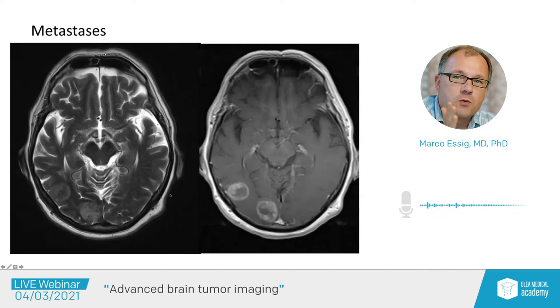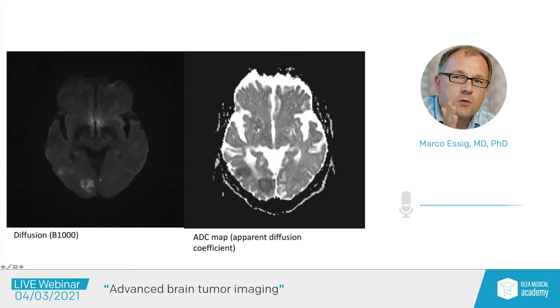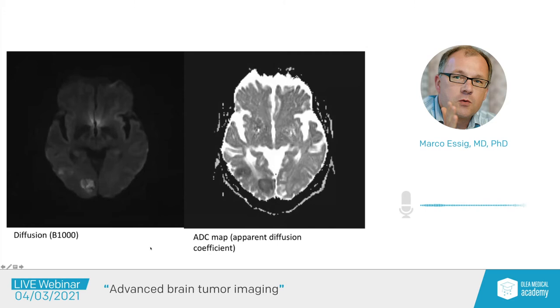Here we see a patient with multiple rim-enhancing intraaxial mass lesions. The patient has a known primary, so we suspect metastatic disease. You see the enhancement pattern and T2 changes, and when we apply diffusion-weighted imaging, we see restricted diffusion specifically along the enhancing margins — the active lesion part where there is high cellular density and active growth. Those areas are restricting, which is a very important tool to better delineate these lesions, helpful for treatment planning.